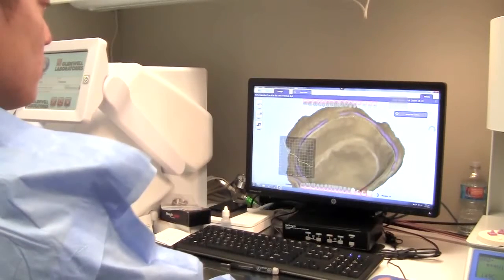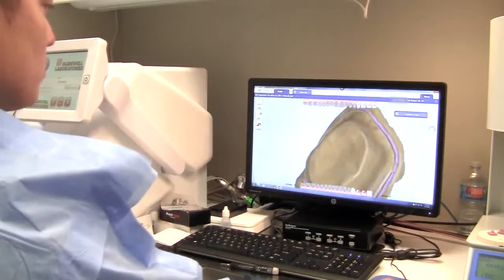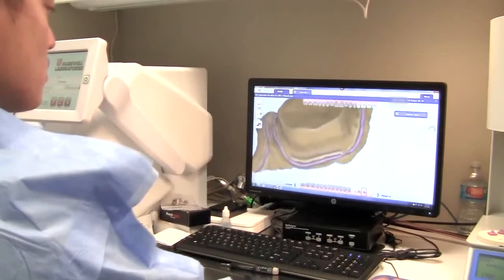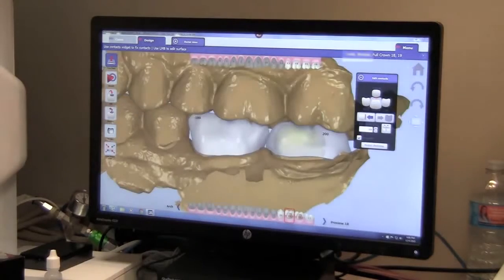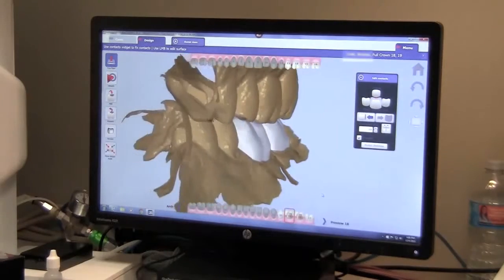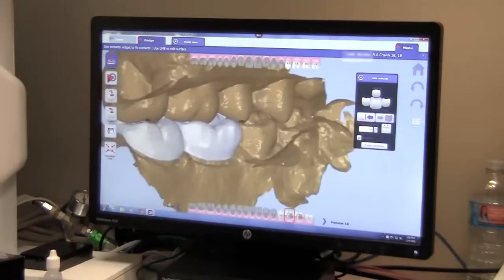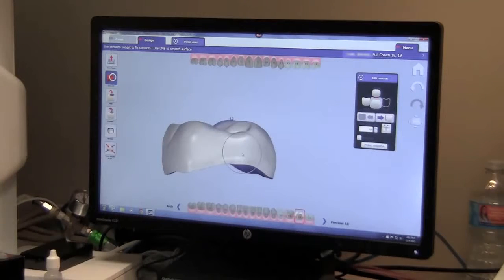Then it's time to mark the margins, and just going back to proper tissue retraction. That's why it's so critical, because now it's up to you, or if you delegate to your assistant, which is also very, very functional, to make sure the position is set properly. The buccal and lingual position of these molars are set where the buccal cusps are within good function in the central fossa of the upper molars of 14 and 15. This off to the TS150.